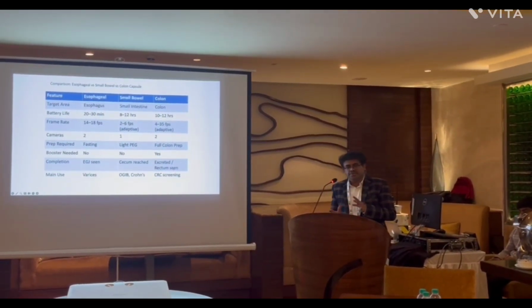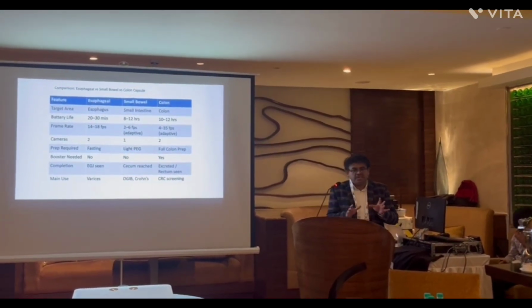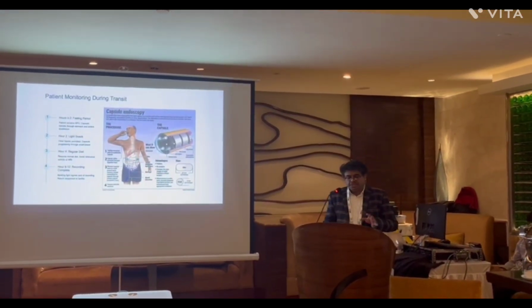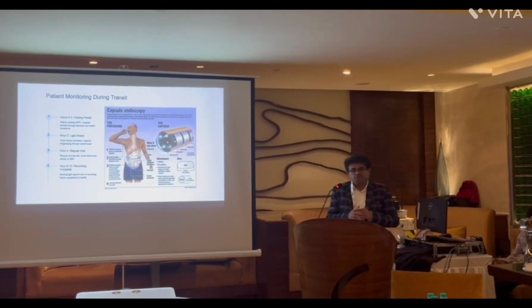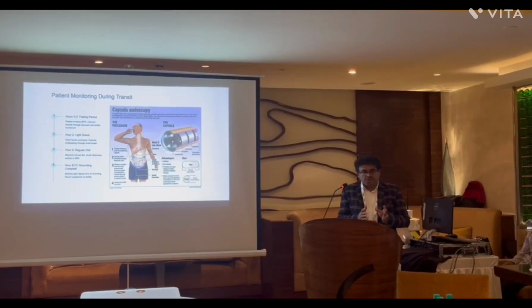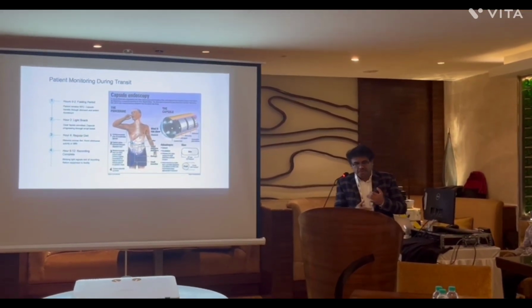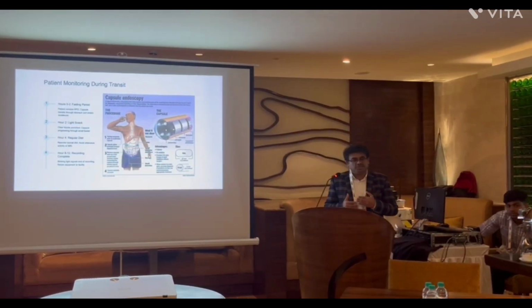Even with the colonic capsule, stool makes visualization difficult most of the time. That is why aggressive bowel preparation is needed when you look for evidence with the colonic capsule. This is the basic outline of the procedure, the diet, and the recording. With capsule endoscopy, be very conscious and make sure the patient excretes the capsule within 48 to 72 hours. That is how we diagnose. If the patient is not passing it within 72 hours, the risk of capsule retention is higher, so we need to be very cautious with that kind of patient.